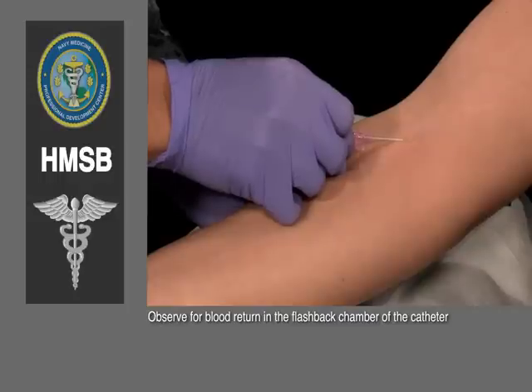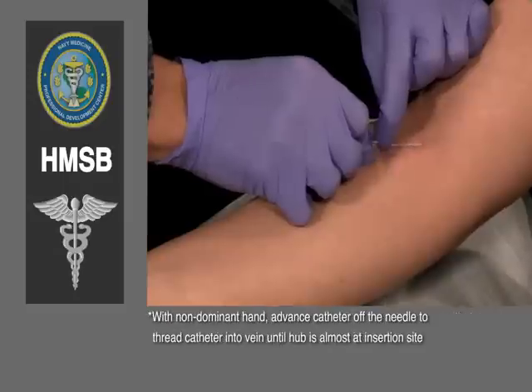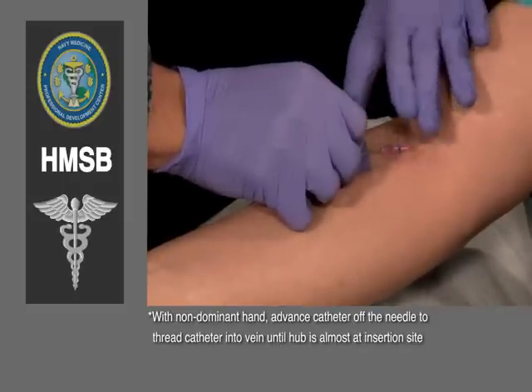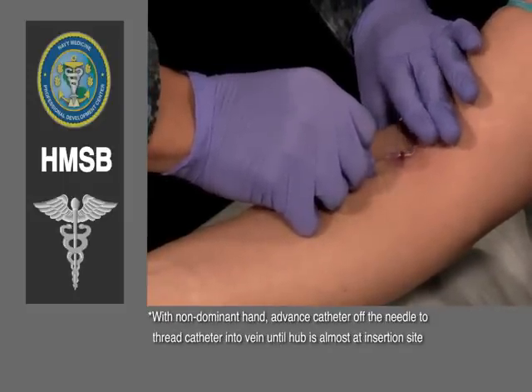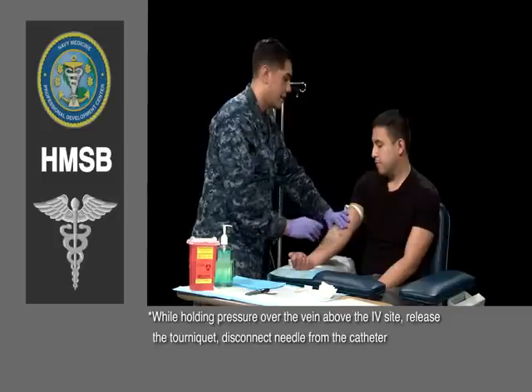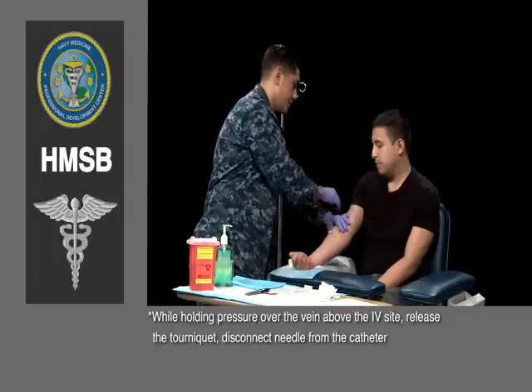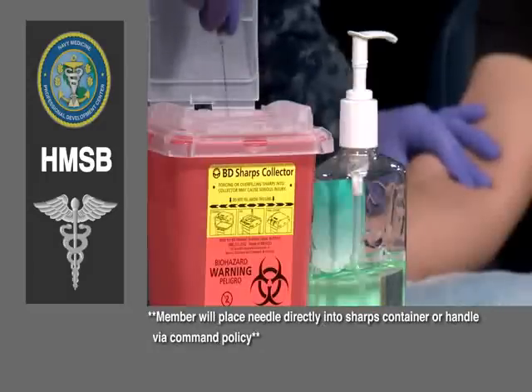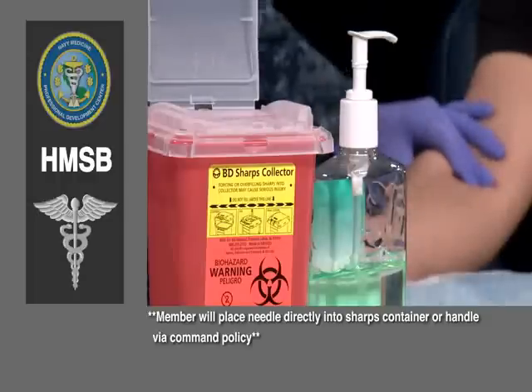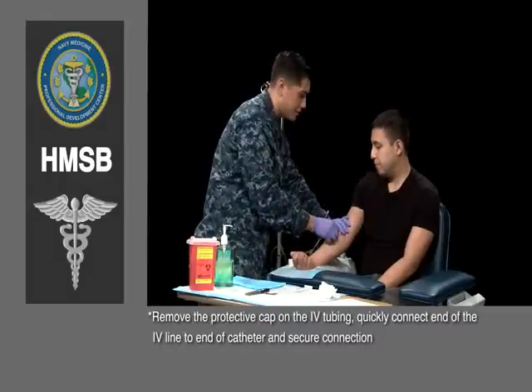I'm going to observe for blood return in the flash chamber. I'll then lower the catheter needle until almost flush with the skin and advance the catheter off of the needle to thread into the vein until the hub is almost at the insertion site. With my non-dominant hand, I'm going to occlude the vein, release the tourniquet, remove the needle, and place it into the sharps. I'll then quickly attach the IV tubing to the site.